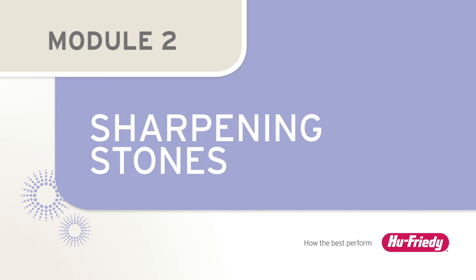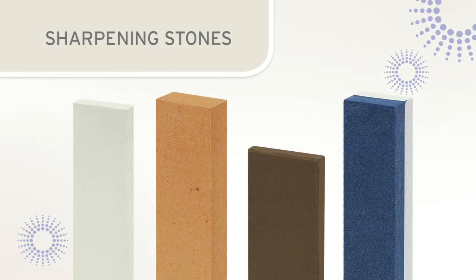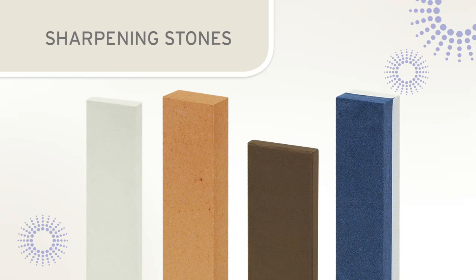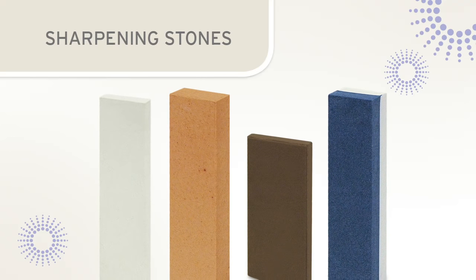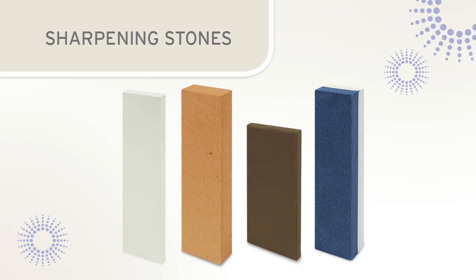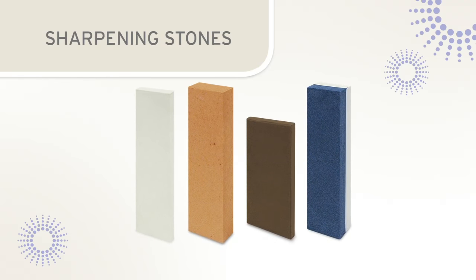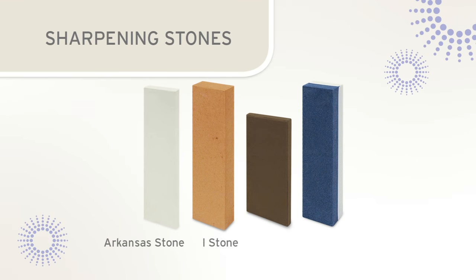Sharpening stones are used to restore the cutting edges on dull instruments. In order to produce consistent and accurate cutting edges, it is important to select the proper stone for the sharpening task. Sharpening stones are available in a variety of types and grits. Stones with coarse grits will grind away metal at a faster rate than those with a fine or medium grit. Sharpening stones are generally classified into three categories: Arkansas stones, India stones, and ceramic stones.